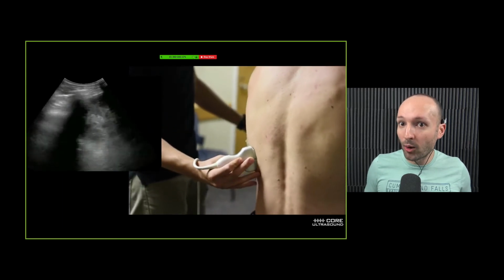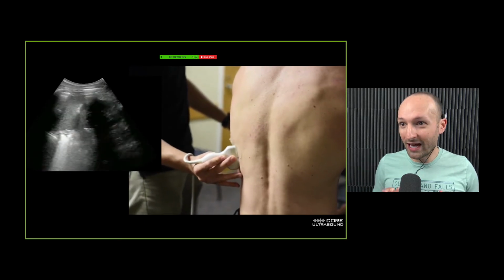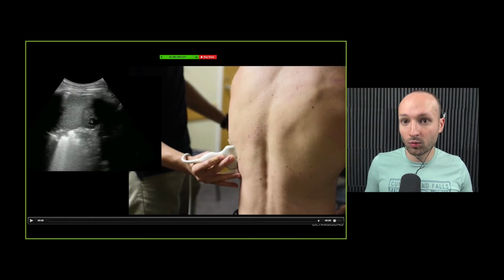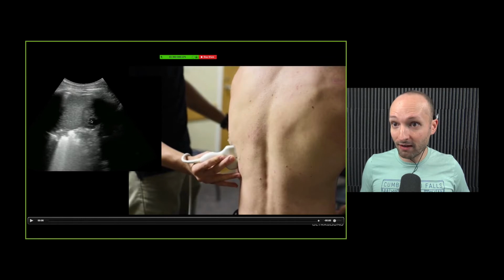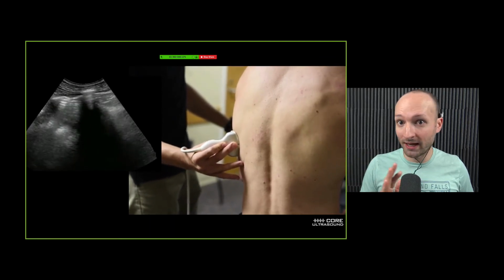Now, let's talk about how I look at the back. So what I do first is I identify where the abdomen is. So if you look here, this over here is the spleen. There's a little bit of the kidney right there. So when I see abdominal organs, I know that that is basically the limit of the thorax. I'm right underneath the thorax, right? So what I do is I find that first, and then I go up a rib space or two above that, and that's where I start my examination.